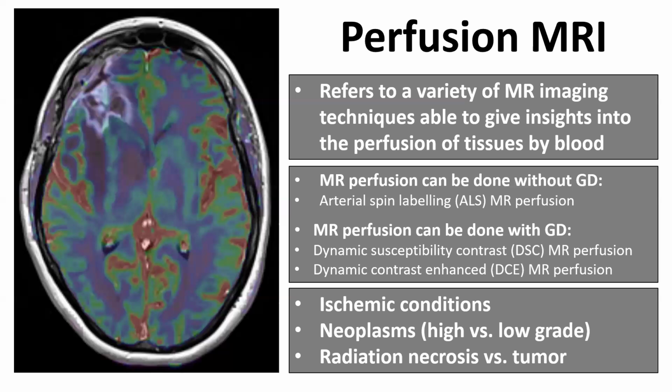Why do we use MRI perfusion? What are the indications? Ischemic conditions, and then especially patients who have a chronic stenosis or Moya-Moya syndrome, for instance, and whom we want to evaluate the so-called cerebrovascular reserve. We want to have an idea of the degree of perfusion of the brain parenchyma and evaluate if this brain parenchyma is hemodynamically at risk.